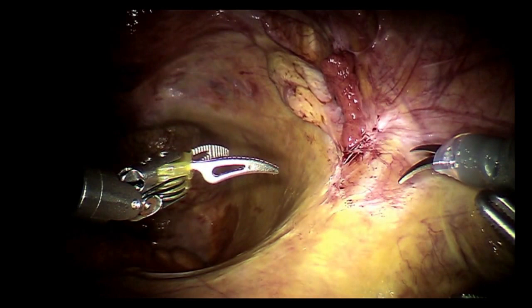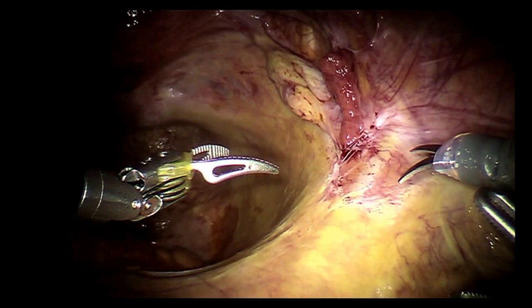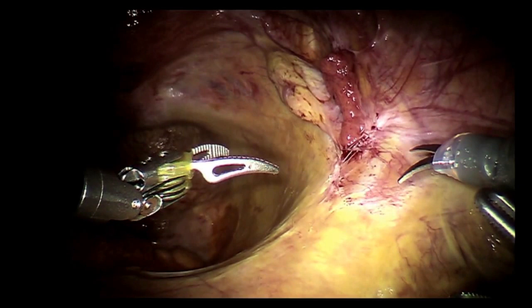She is a 39-year-old lady with end-stage renal disease due to hypertension and has been on peritoneal dialysis, so the peritoneum has some reaction as a result of that. We are going to be planting it on the right side. After the external iliac artery and vein are dissected out, then we would drop the bladder down and prepare the bladder. In patients who have significant atherosclerotic disease in the external iliac artery, we have used the internal iliac artery in 1 patient, which works very well too.